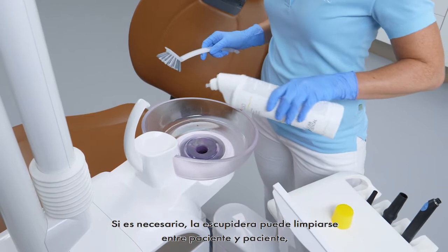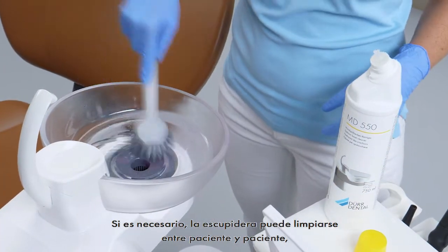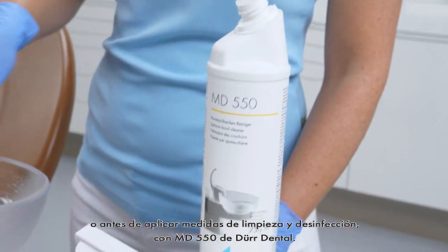If necessary, the spittoon can be cleaned between patients or prior to cleaning and disinfection measures with MD-550 from Der Dental.